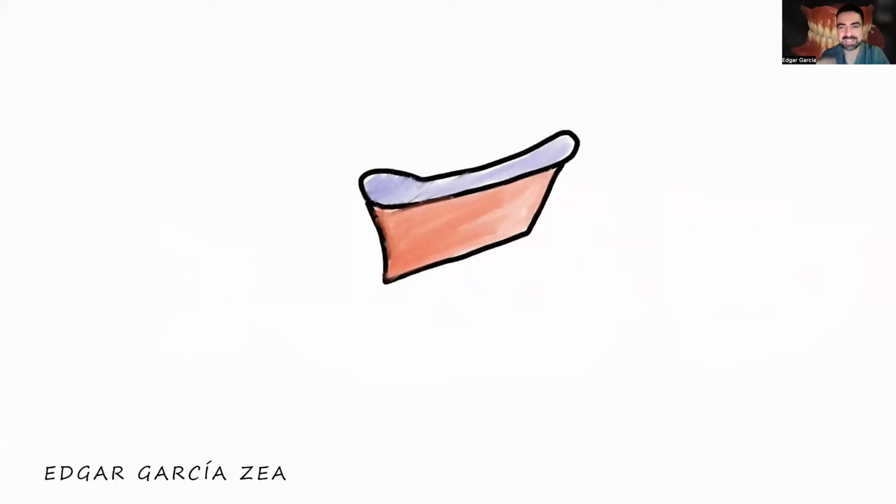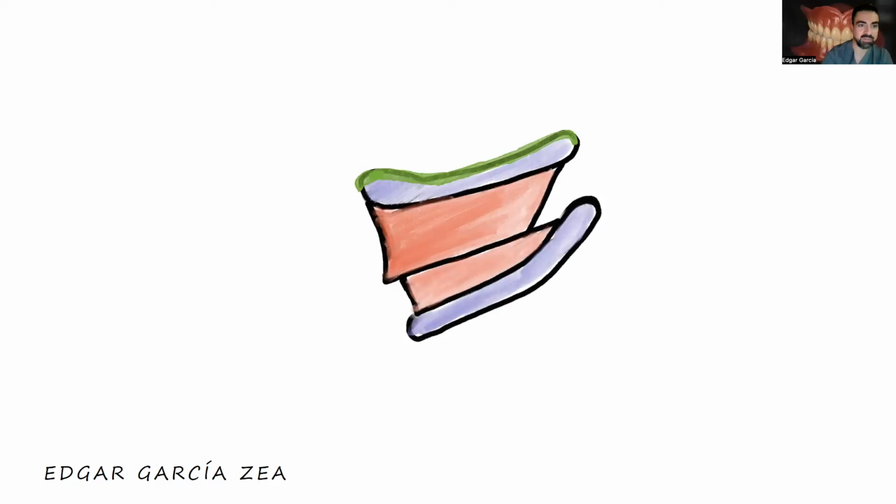So here's the summary. The first thing that I do is the maxillary border molding. After this, I modify the upper rim. I use the Fox plane. I check the midline and the inclination of the occlusal plane, from a front and lateral view: the midline, the smile line, the canine line, everything. After this, I obtain the vertical dimension that we want. So we adjust the lower one with the upper one.